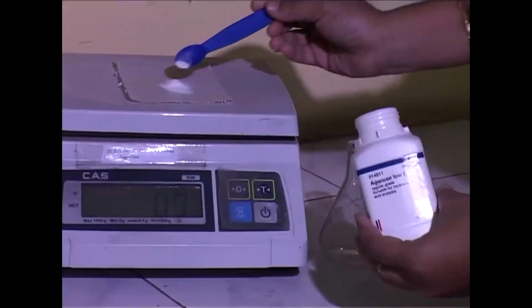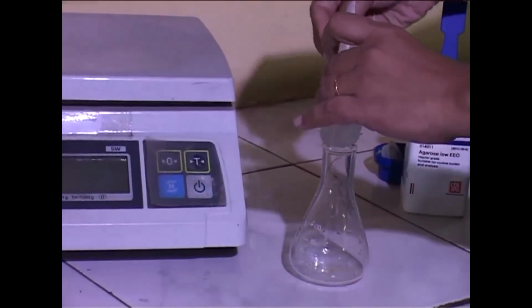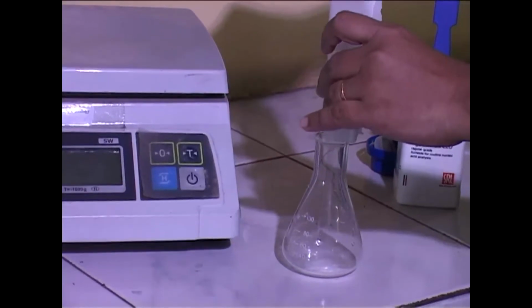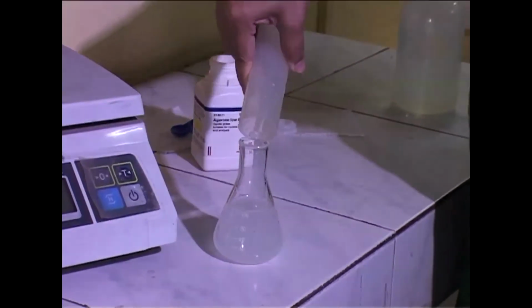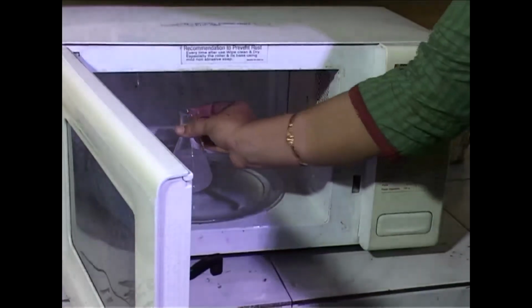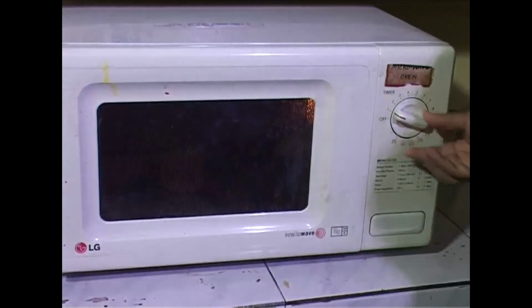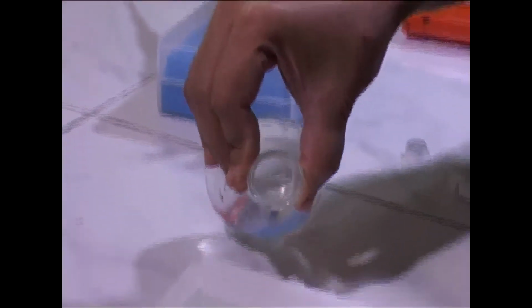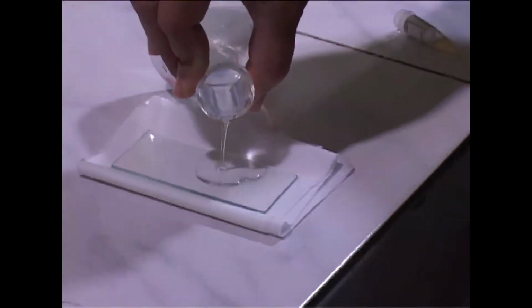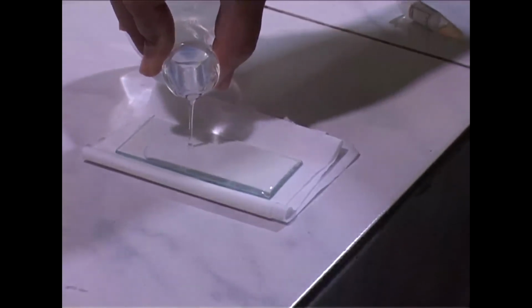We have to prepare 1.2 to 1.5% agarose. Weigh that amount of agarose, take it in a beaker with water and then melt it. Then you add the antibody when the molten agarose has a temperature around 45 degrees centigrade. Mix it properly to make the antibody concentration uniform, and then pour the molten agarose containing antibody on a glass slide. Let the agarose solidify.